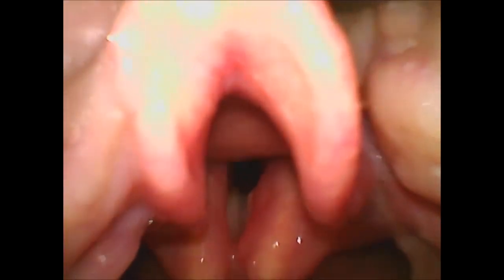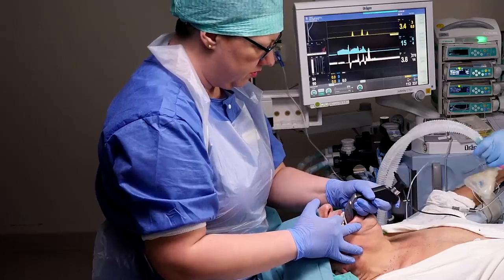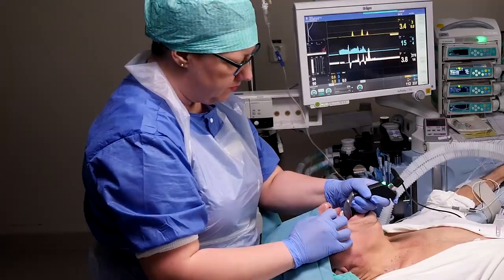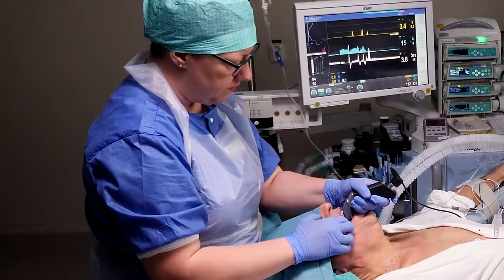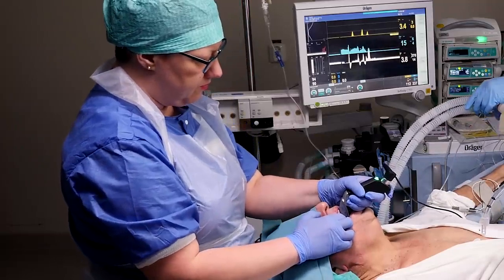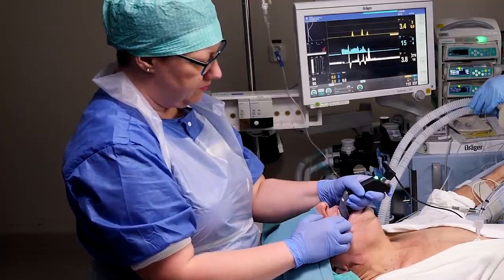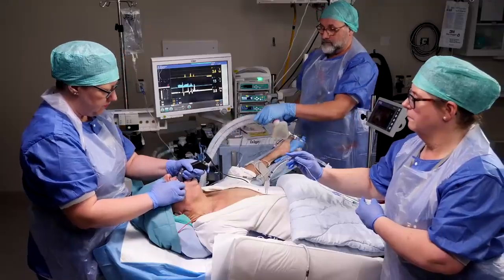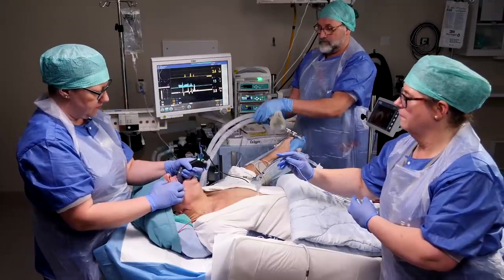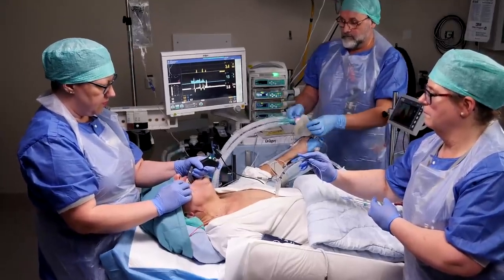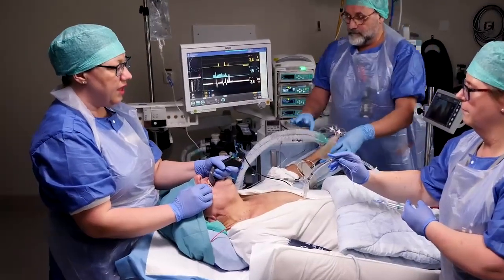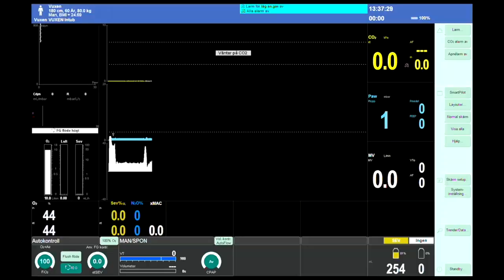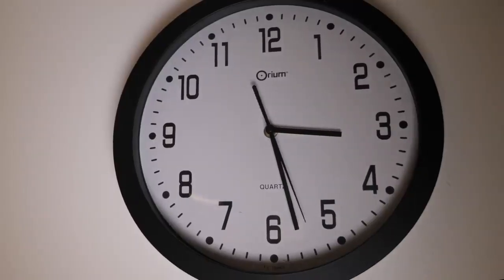A common mistake at this point is leaning forward, as it feels this will give a better view — it doesn't. Stand upright with the left arm at a 90-degree angle tucked in towards your body. This allows for better ergonomics, better communication with the team, and a better overview of the ventilator, the timer, and the patient.